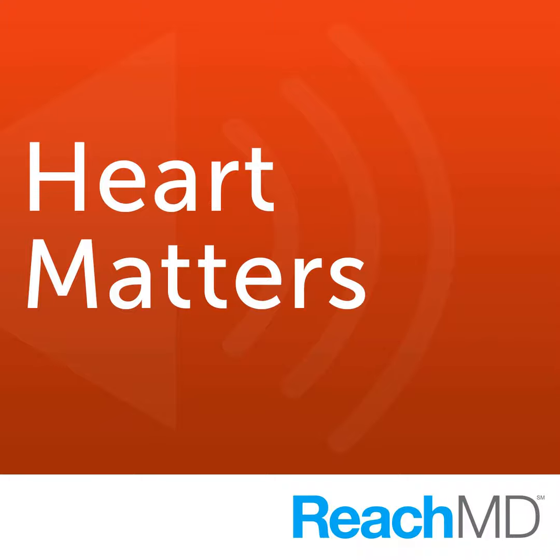We want to learn more today about coronary CT angiography, but I think we ought to start with your description of the difference between coronary calcium scan and a CTA. Well, I think that's an important distinction to make, and basically it's a little confusing because the same machinery, the CT scanner, is used for both kinds of tests, but the coronary calcium test is done without contrast.